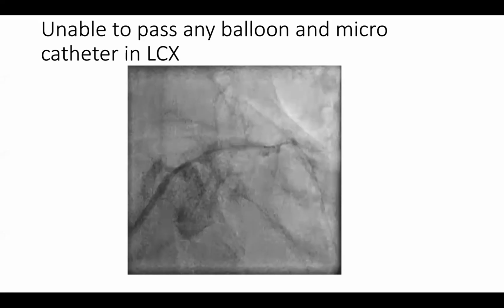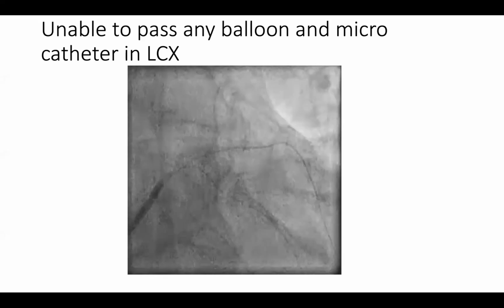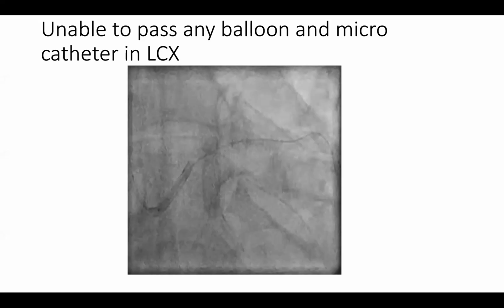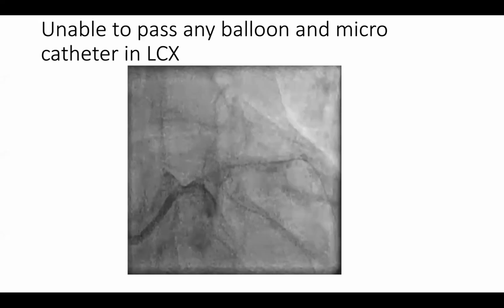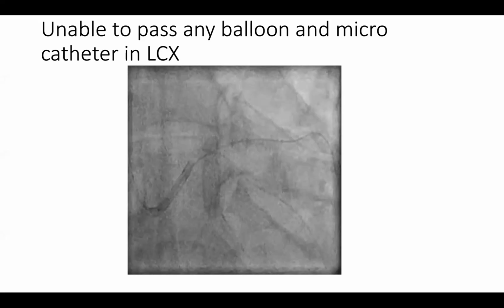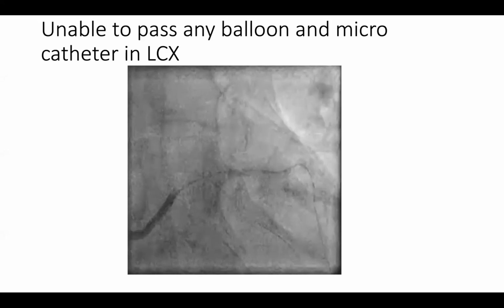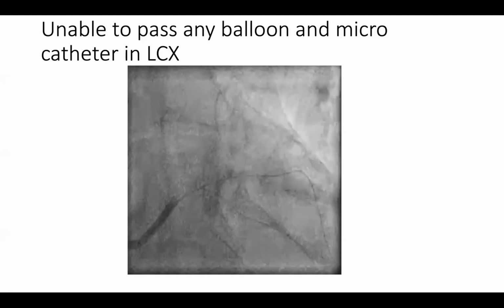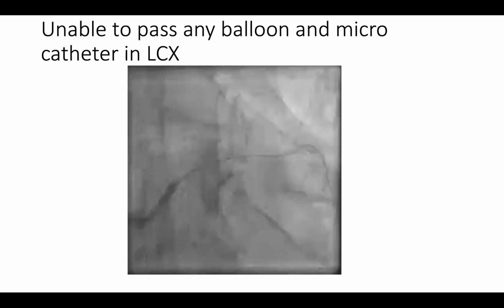The other option could have been using the dual lumen catheter and taking the dual lumen catheter on the support wire, and then pushing the rota wire alongside through the second lumen, because that will give you enough support to push the wire distally. But here, the problem could be either there's a calcium spicule which has become worse after the balloon inflation, or it's an angle.